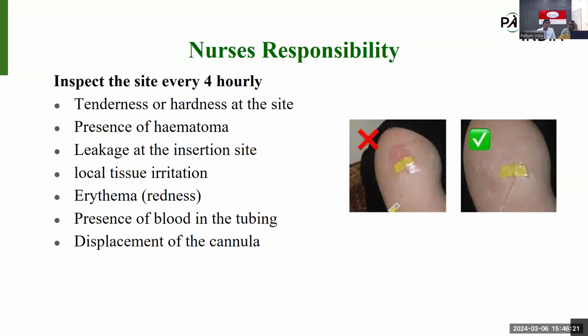Yeah, so thank you. Here we have cancer patients and non-cancer patients. We use subcutaneous infusion for non-cancer patients also. If they are not able to take oral medications, and that patient needs medications, then we will choose the subcutaneous route for infusion.